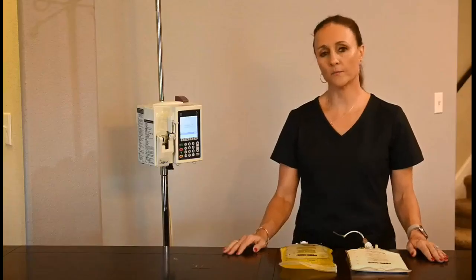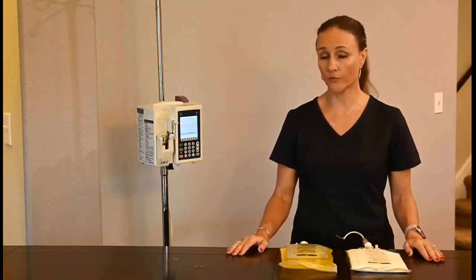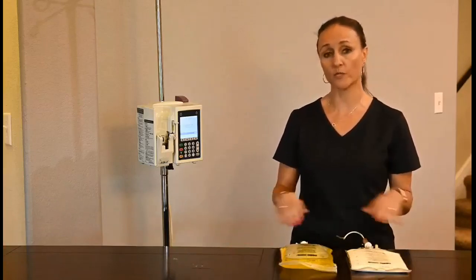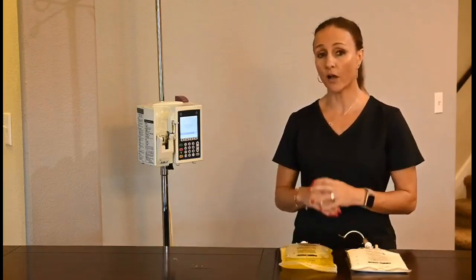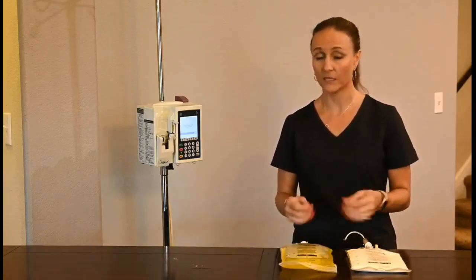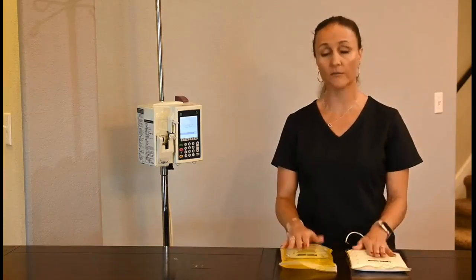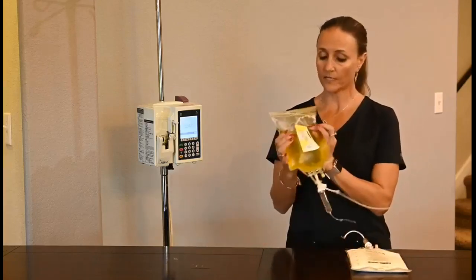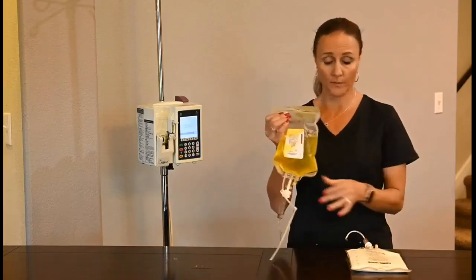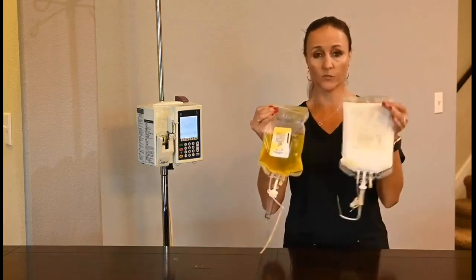Let's talk about TPN and PPN. PPN is peripheral parenteral nutrition, which means we're going to be giving the medication through the peripheral line. It's not very common because it is very vesicant. TPN stands for total parenteral nutrition, which means we're going to give this medication through a central line. You may have a type of TPN or PPN that is a bag that's yellow, and you may have one that's white.